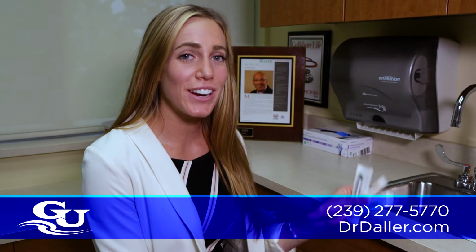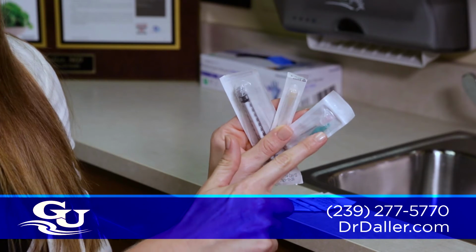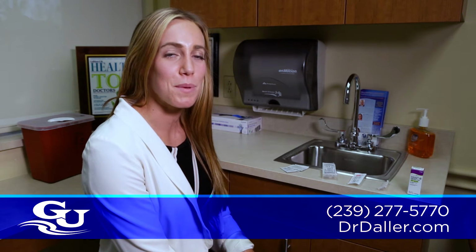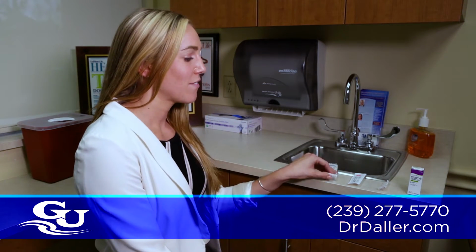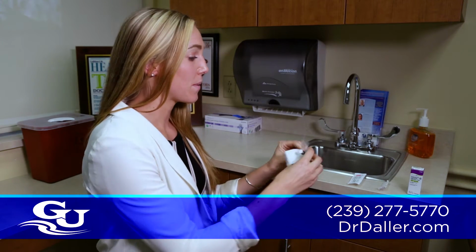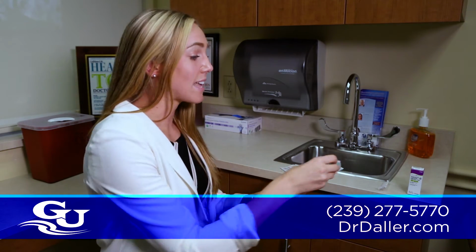The first thing that you're going to do is open your supplies in a sterile fashion. The specific areas that you do not want to contaminate are the tip of the syringe, which is here, and the hubs of your needles, which are here and here. To avoid contamination, make sure that you open your supplies from the proper end of the packaging. Find the ends of the plastic where they easily separate and open them similar to when you open a Band-Aid, just like this. Keep them in the packaging and set them back down.